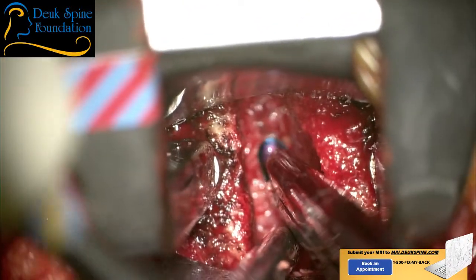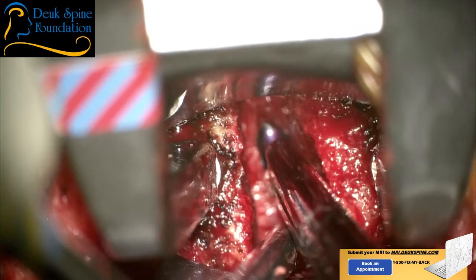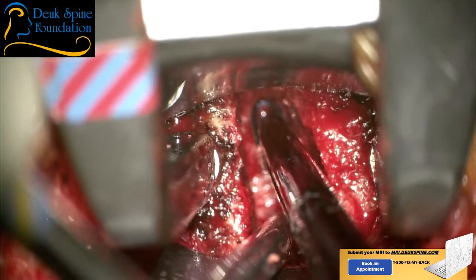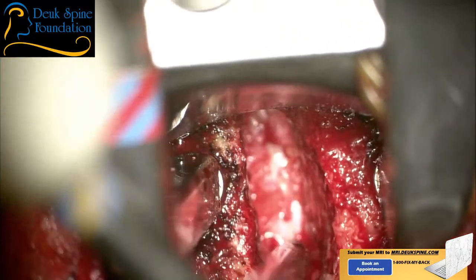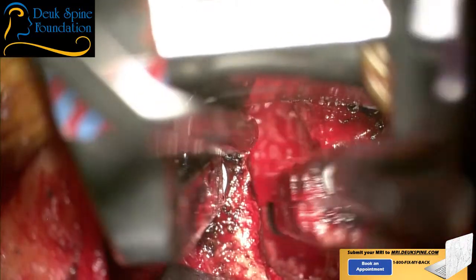See that vein right there, that purpley vein? That's right where the nerve root goes out the foramen. I want to try to not cut that vein, but it looks really good right here. I don't see any more compression on the root. And then my side looks good. So I feel like the foramen is wide open now.